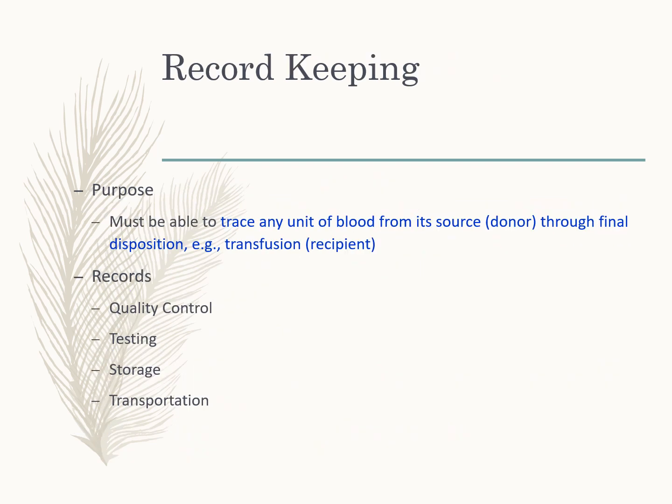So record keeping is extremely important. There's the saying, if you don't document it, it didn't happen. You have to record everything you do, because in 2 years when you get inspected, or in 2 months when they're investigating a transfusion reaction and they say, why did you issue this unit? I don't see compatibility testing. And you think, oh, I know I did it, but I didn't record it. If you don't document it, it didn't happen.